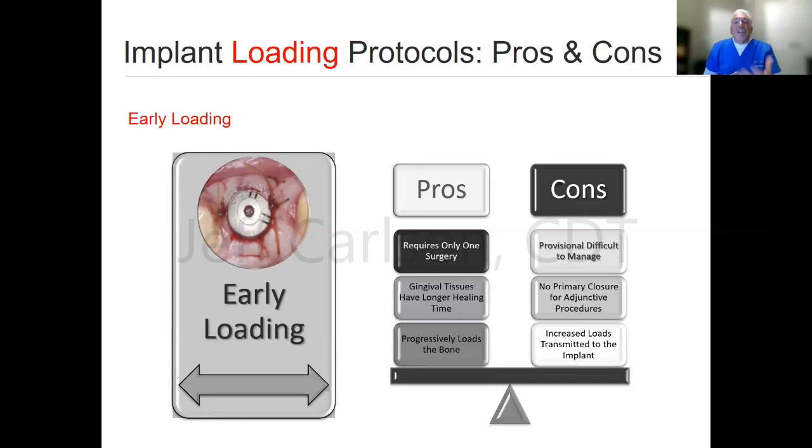So I just want to share that with you, that if you love the tissue, you think the tissue height's right where it's at, and the top of that abutment is level with the tissue, you very likely might see some overgrowth of the tissues there.